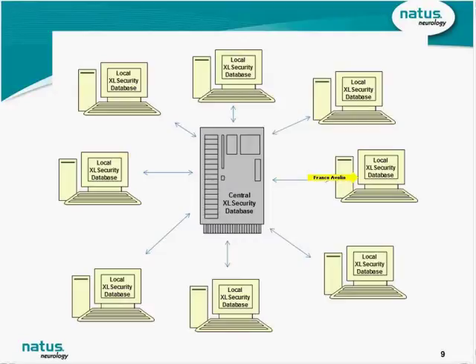However, each computer communicates with the central XLSecurity database and compares its security rules with the rules of the server. So there's an interaction between the computer and the server on a regular basis, where each machine makes sure it has the latest rules and guidelines that govern how a user should be interacting with the system.